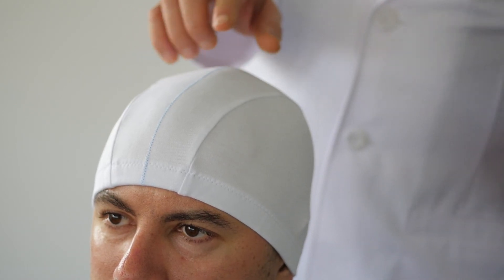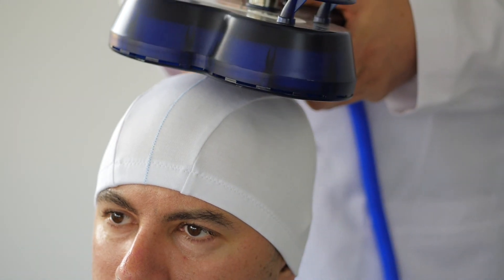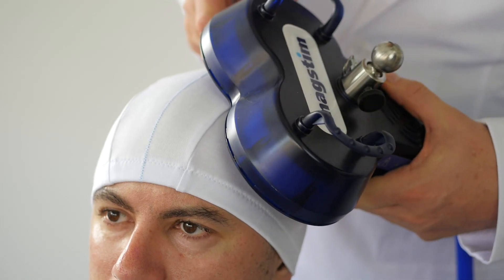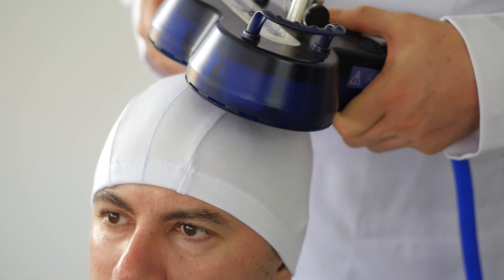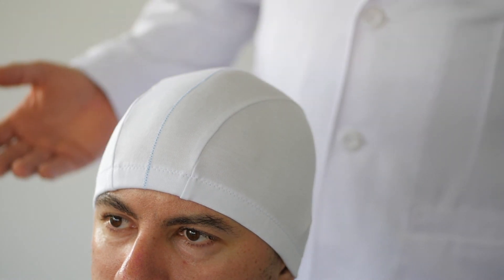When lining up to M1, you have several options depending on how medial or lateral you are. The more lateral you go, the more you want to take a 45-degree angle so the stimulation is neutral. For stroke, the stimulation is typically contralateral.